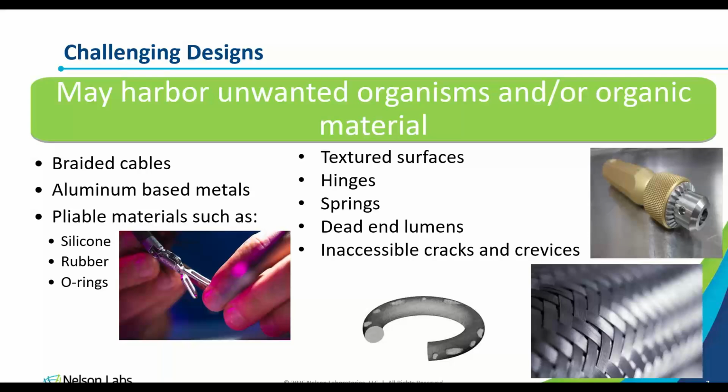Now, for single-use devices, it still is an important endpoint that needs to be tested and evaluated. Whereas for reusable devices, in terms of the cleaning validation, it's not viewed as an applicable endpoint, and other endpoints like protein or hemoglobin or total organic carbon are viewed to be a bit more applicable in reference to residual contamination from patient after the cleaning process.